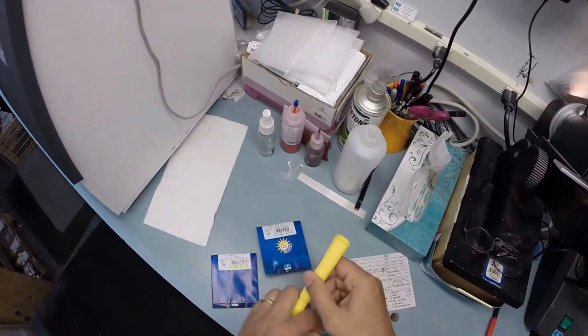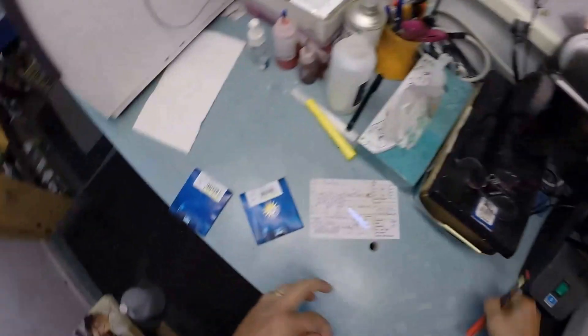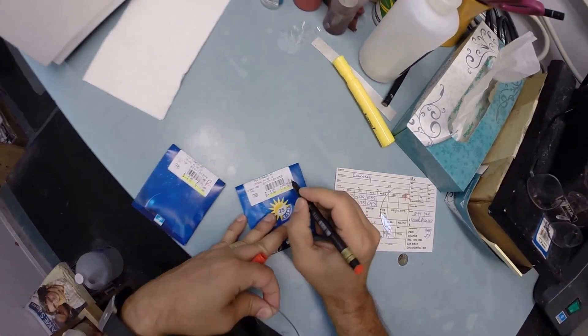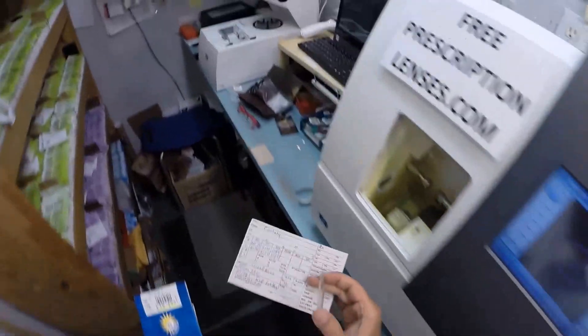I didn't label the left lens. Plus 50 minus 75. Now these packets come in both plus cylinder and minus cylinder. Many years ago they used to put plus cylinder on the front of the lens. Now everything is on the rear surface so it is minus.